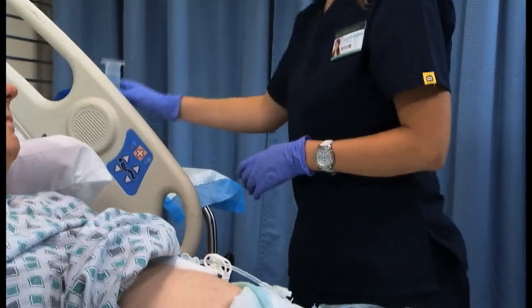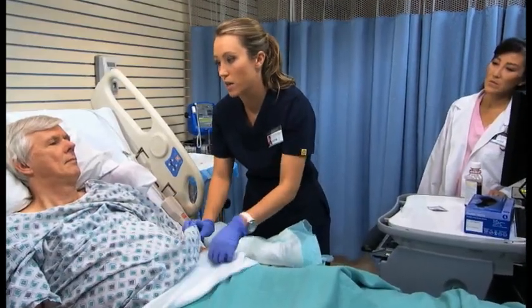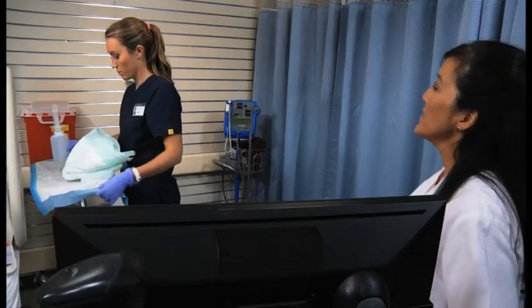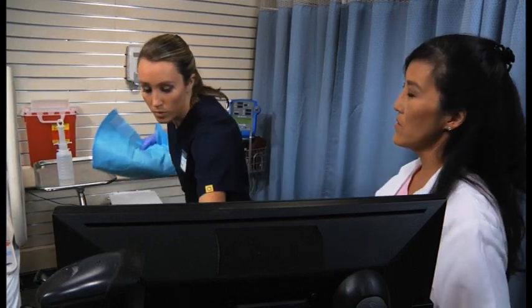And if the patient was receiving a feeding through the tube? Then I would reattach the feeding tubing, unclamp the gastric tube, and restart the tube feeding. If the patient's receiving a tube feeding, the head of the bed must remain elevated at least 30 degrees. You can remove your gloves now.